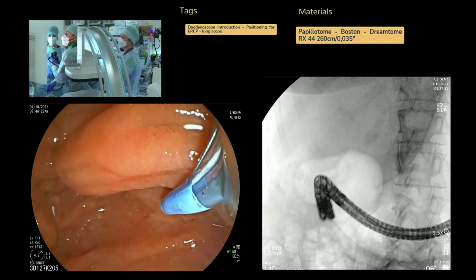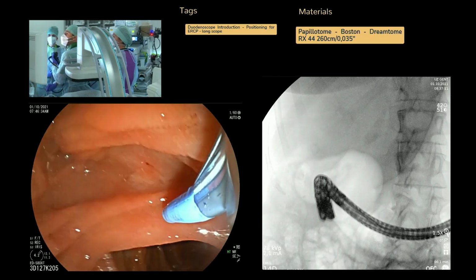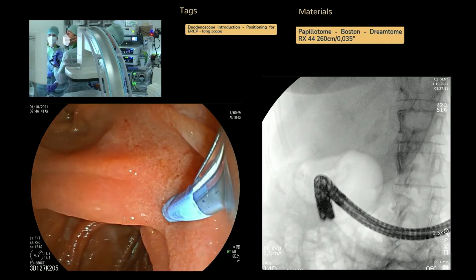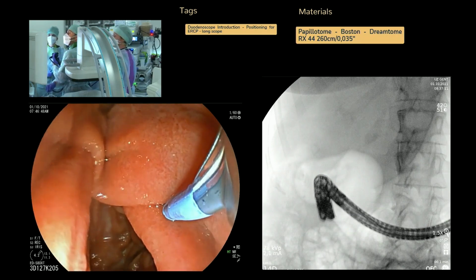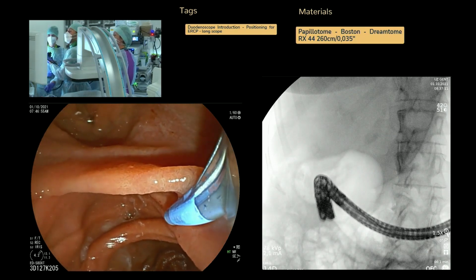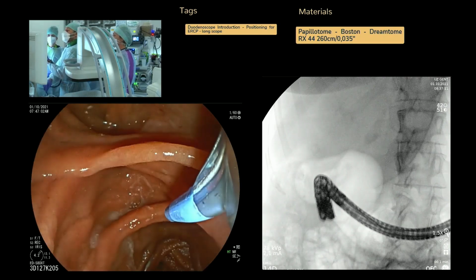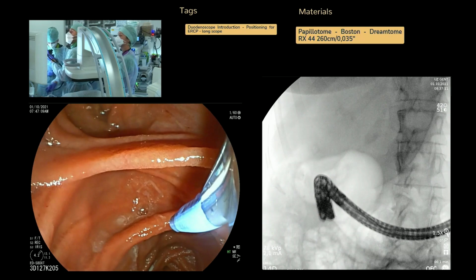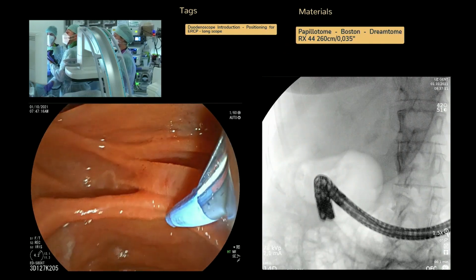No, I have roughly the same. But of course, there's not a real definition of wire-guided cannulation. Some people think wire-guided cannulation is only the wire and you don't touch the papilla with your device. Other people say, well, if you don't use contrast as a primary means, that's wire-guided cannulation. But I prefer also to put the tip of my sphincterotome or cannula in the orifice. The problem is that, of course, the sharper the sphincterotome is, the more traumatic it gets. These sphincterotomes are quite sharp, so you need to take care. It is easy to create a false route.